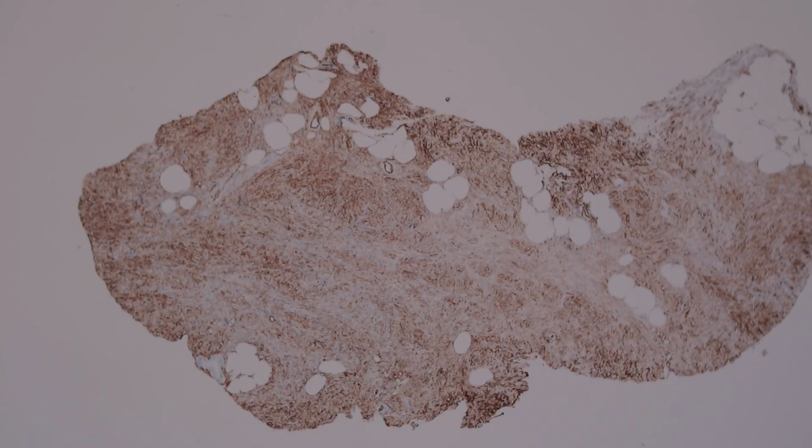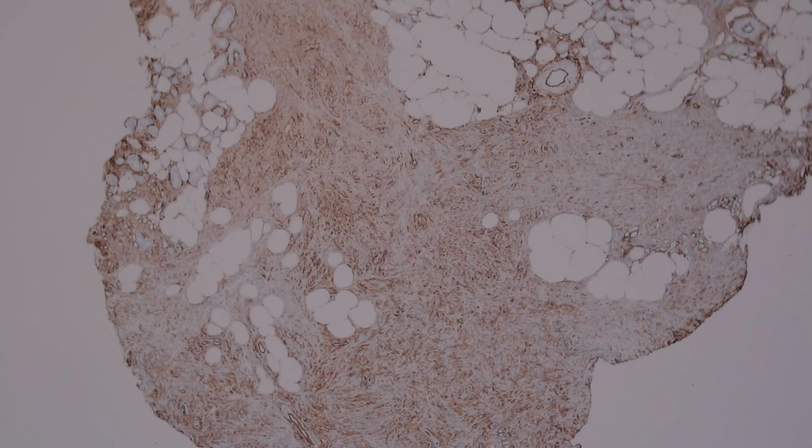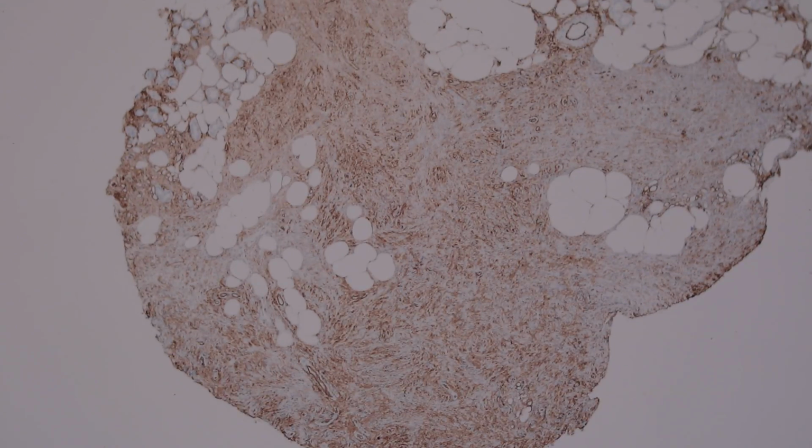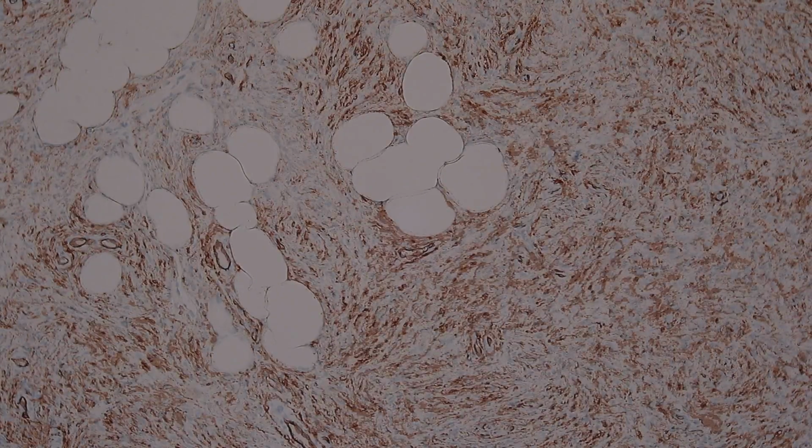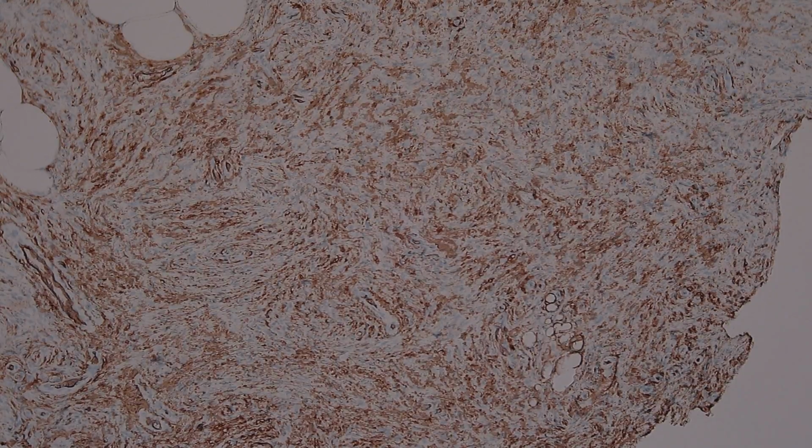Here, I think I have a DFSP actually handy right here. Now this is just a chunk of dermatofibrosarcoma protuberans with no normal around it, but you can see this is tumor. All of this is tumor, and it's diffusely positive, and it's infiltrating and entrapping adipocytes with that classic honeycomb pattern. So this is what CD34 looks like in a DFSP, and again, that's a topic for another video.